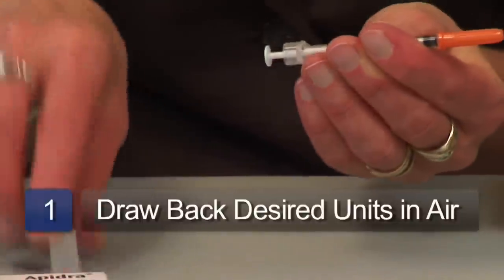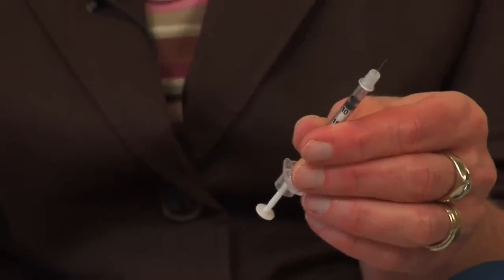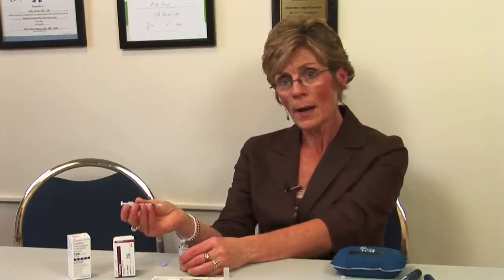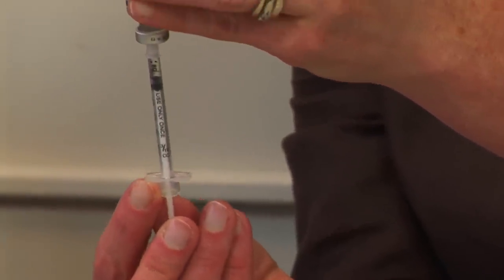With a vial and syringe, we pull off the plastic piece and the cover, and we draw back however many units of air we're going to need, because first we have to put air in to match the amount of insulin we're going to take out so we don't create a vacuum in the bottle — otherwise we'll have a hard time getting the insulin out. So I'm going to draw back five units of air, put that in, flip it over, and draw back five units of insulin.